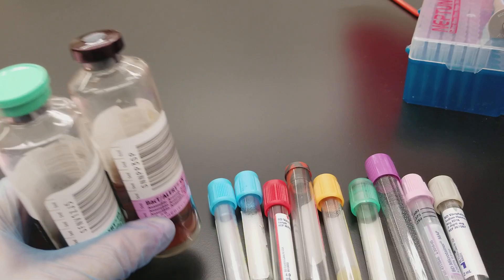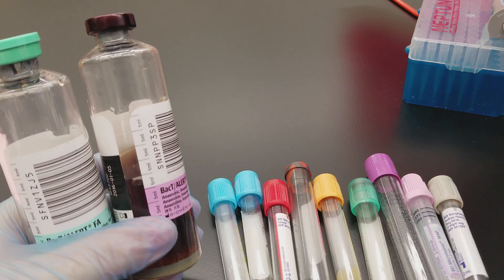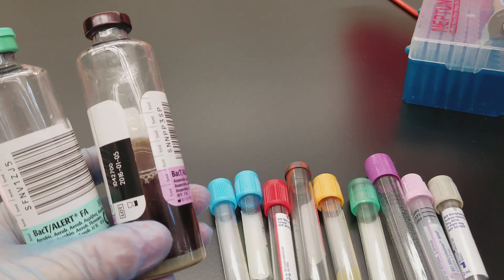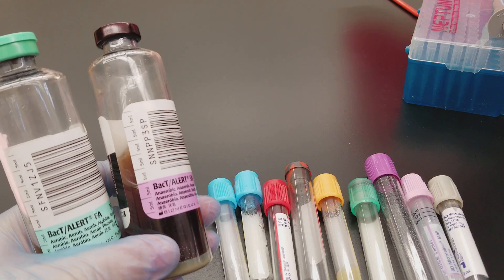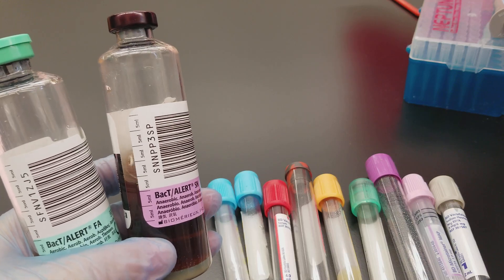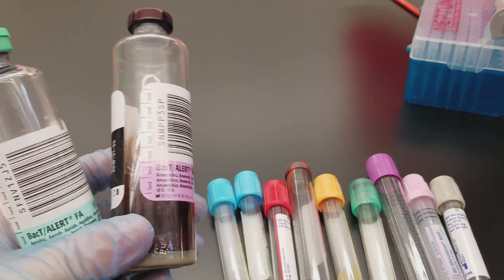There is an anticoagulant in the blood culture bottle that pulls out calcium and is going to reduce complement from acting and being initiated in the patient's blood, because complement does destroy bacteria. So we don't want them to die — we want them to actually grow. It also slows down phagocytosis and reduces any antibiotic therapy that they might already be on when they have been drawn.